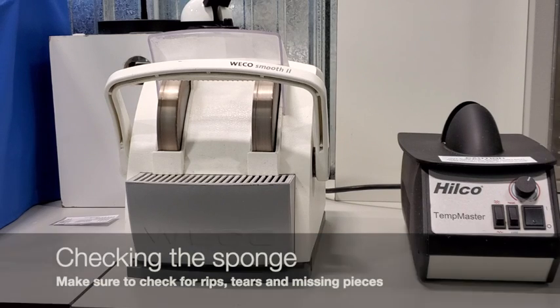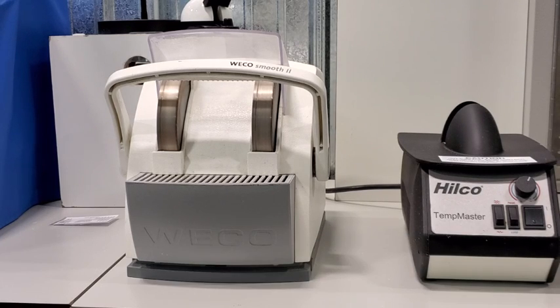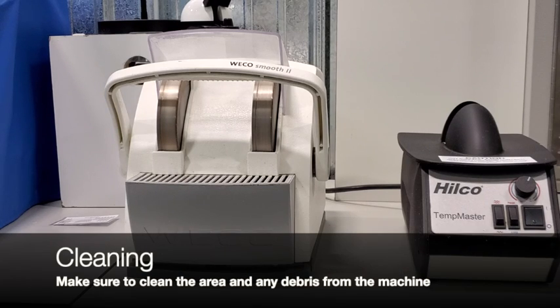So pretty easy. As far as closing goes, we're just going to clean off our area. We're going to vacuum it if there's any lens swarf or debris, and make sure our unit's clean and ready to go for the next day.